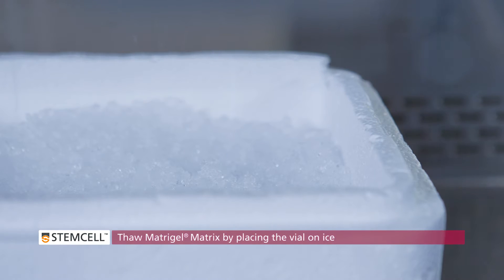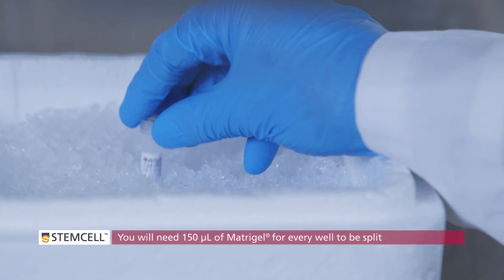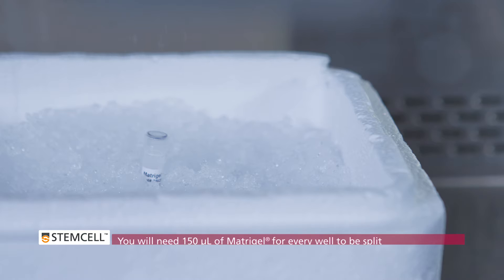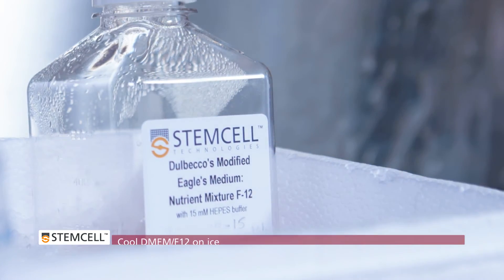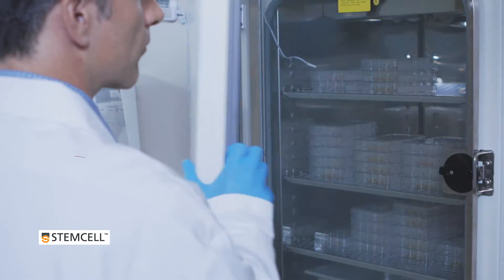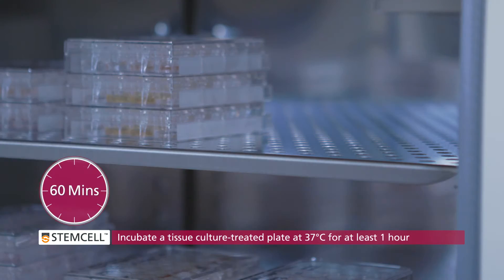Also thaw matrigel matrix by placing the vial on ice. You will need 150 microliters of matrigel for every well to be split. We recommend using growth factor reduced and phenol red free matrigel matrix available from Corning Incorporated. Cool DMEM F12 on ice. Place gentle cell dissociation reagent on ice. Place a tissue culture treated 24-well plate in an incubator at 37 degrees Celsius.